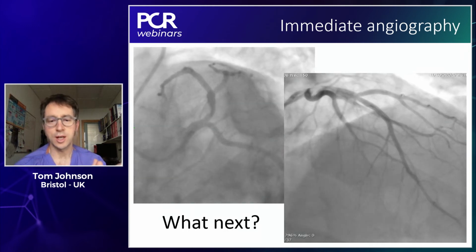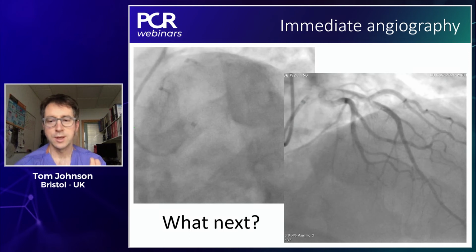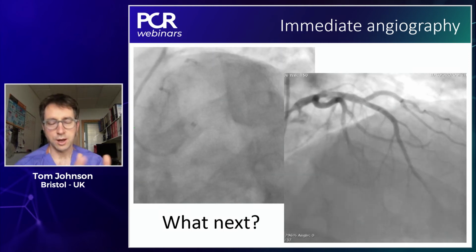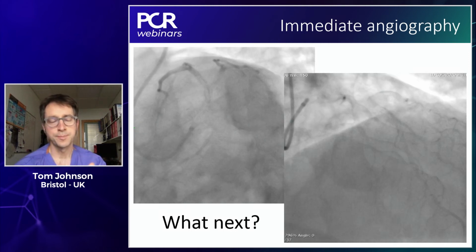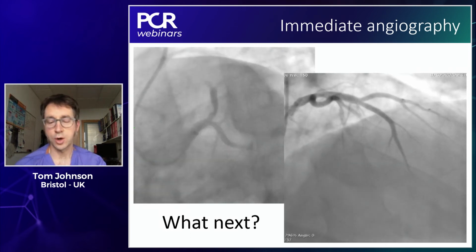I'm going to image it, understand better what's going on. He's already had an insult to his apex. He's showing a highly threatening presentation. We need to do something. And I think it's important then to consider the options.